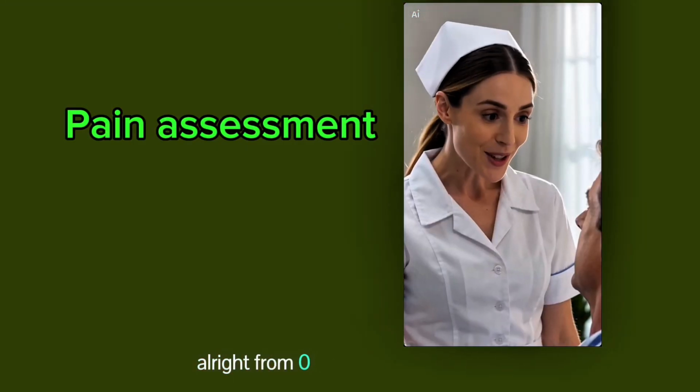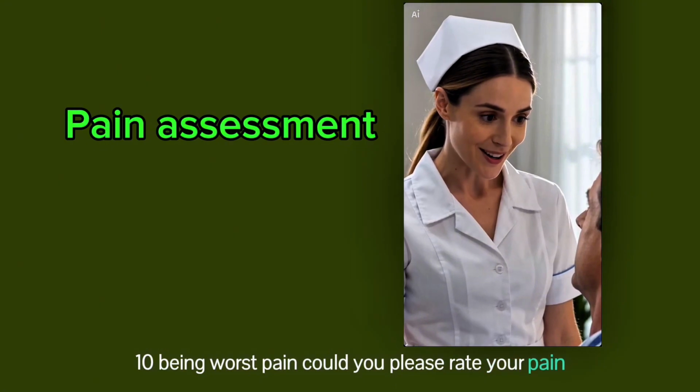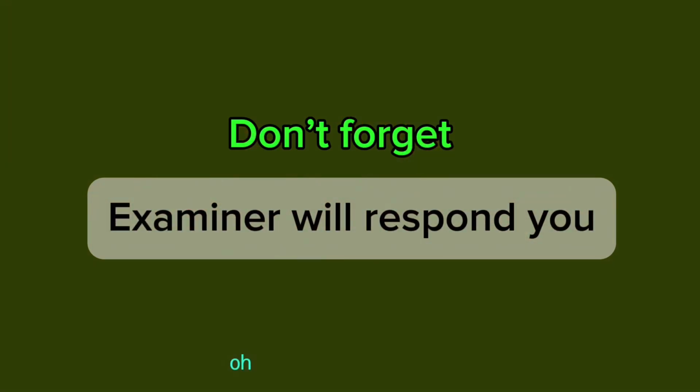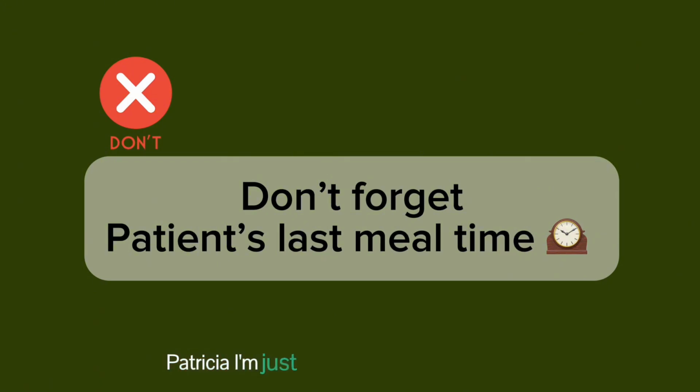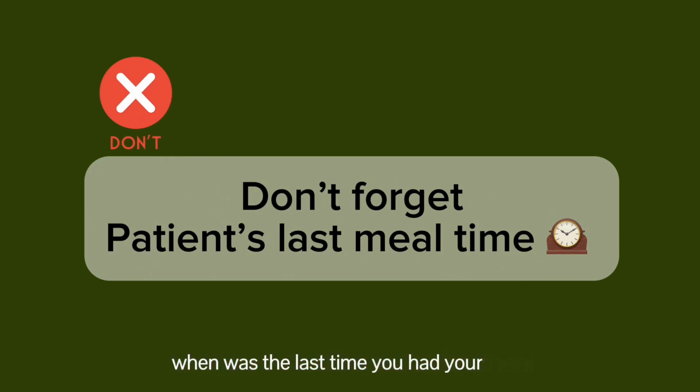Alright, from 0 to 10, 0 being no pain, 10 being worst pain, could you please rate your pain? Patricia, did you check your blood glucose level this morning? Can you tell me the level? Oh, that's within the normal range, so I need to give you your regular insulin now. Patricia, I'm just going to prepare the articles that we need for today. Before I go, just one question. When was the last time you had your meal?